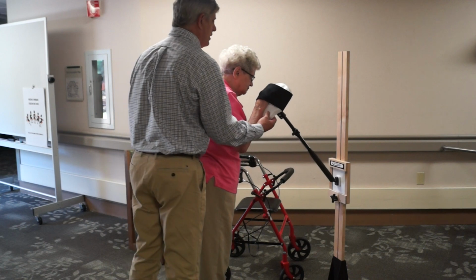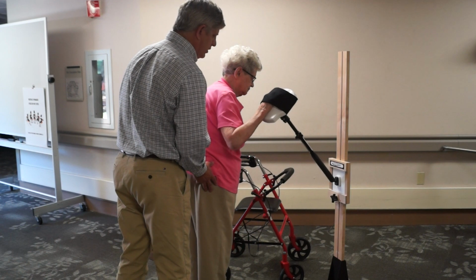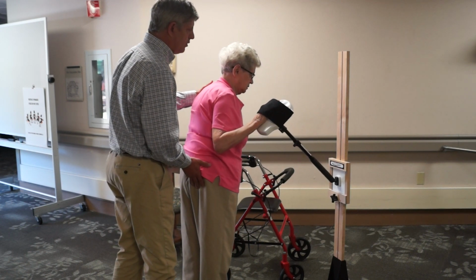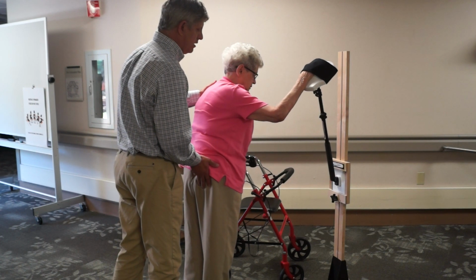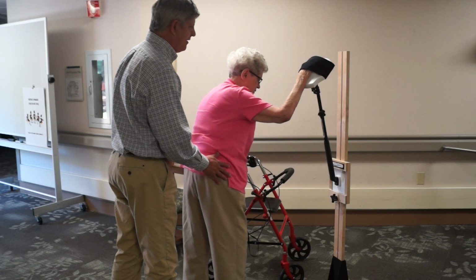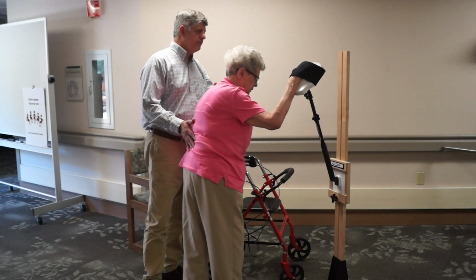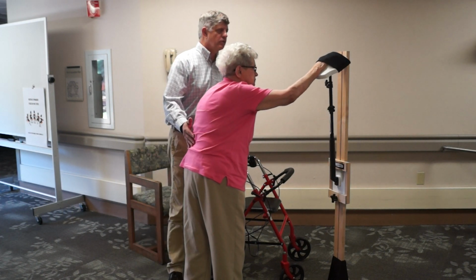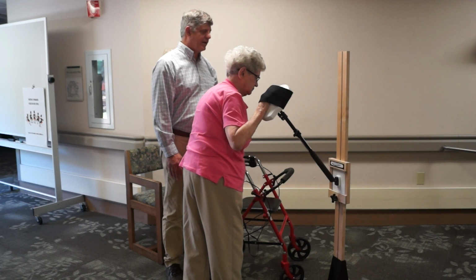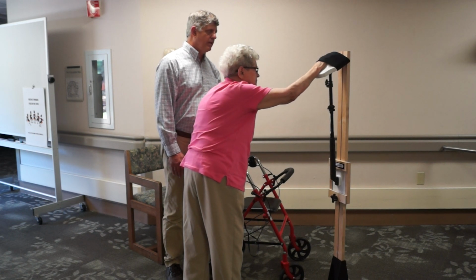There. Now you can reach, and you could transfer your weight forward just a little bit when you reach. Oh, not bending over. Just put a little weight onto your front leg, your right leg. Okay. There. That's it. All right. Oh, wonderful. Okay. Now remember to reach, or look where you're reaching to. Good. Come back down. Nice work. You hit that target, didn't you? Yep.